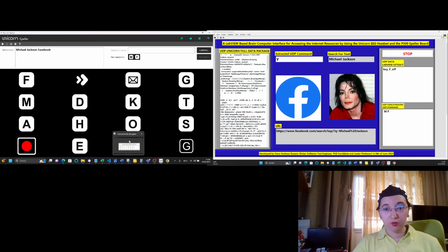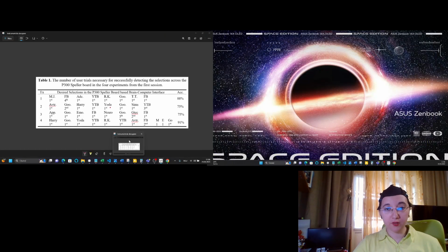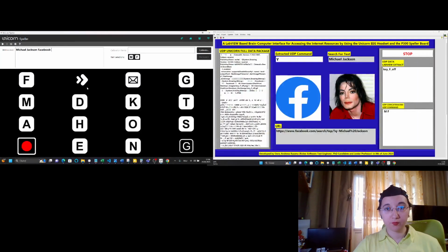So we want to search for Adele in YouTube. Firstly, I want to select this symbol D, and then I want to select the above symbol related to YouTube.